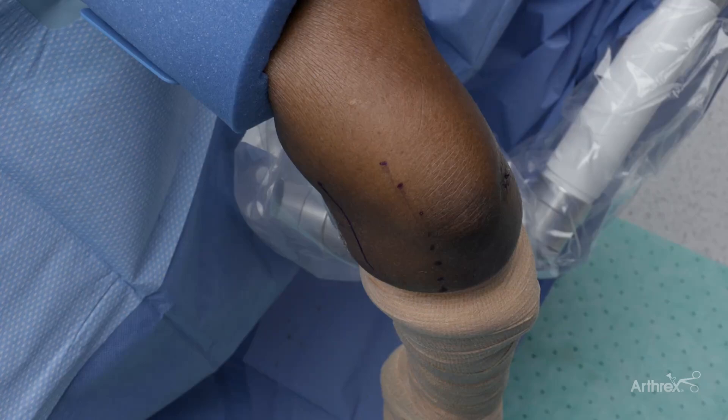Hello, this is John Vijack from Miami, Florida, discussing nanoarthroscopy camera and instrumentation for elbow arthroscopy.